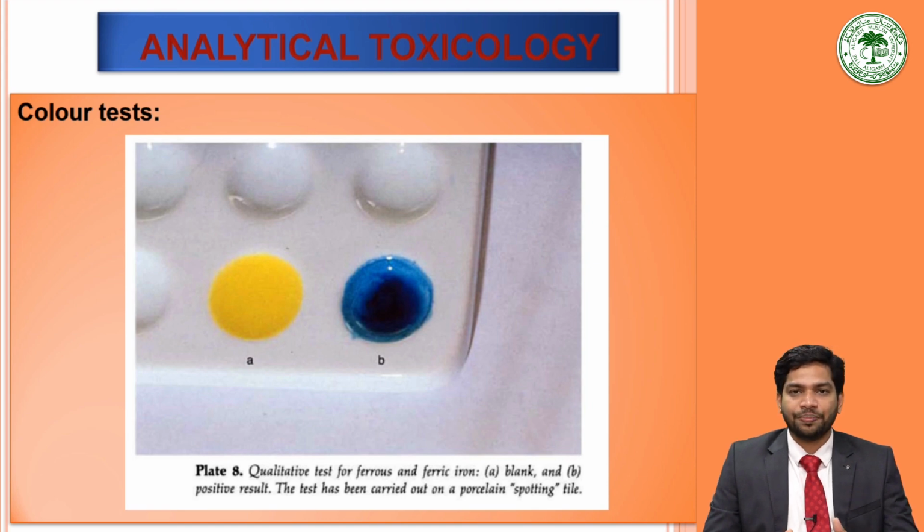Then leave the sample for 5 minutes at ambient temperature and then centrifuge it for 5 minutes. Deep blue precipitate with potassium ferricyanide indicates the presence of the ferrous form of iron, that is, a ferrous salt that contains Fe+2.